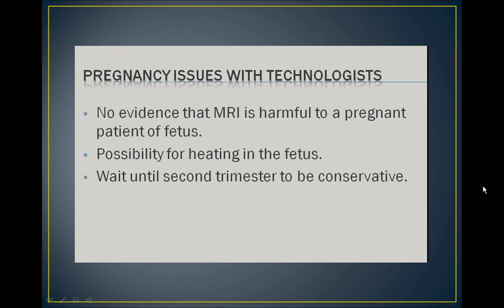Another potential problem in pregnancy and potential risk to a fetus may be heating. Heat is able to disturb the growth and development of a fetus, but the heating from the MRI exposure is almost equal to a pregnant woman being in a steam room or a hot tub, which is not recommended.